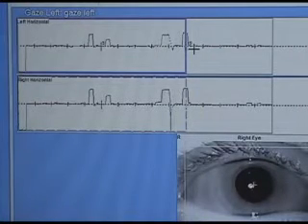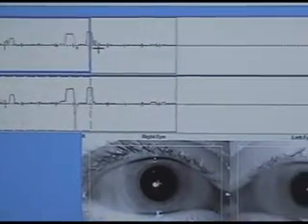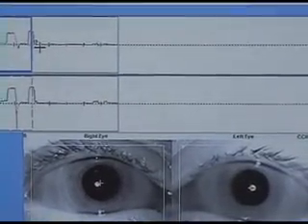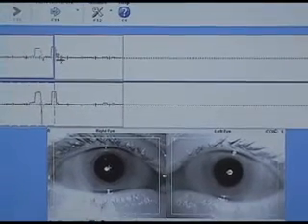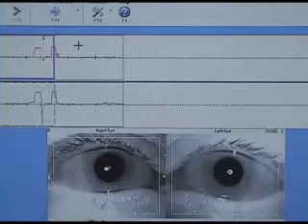It's a failure of a certain part of the brainstem that is not allowing the eyes to remain steady, and we want a nice steady gaze. So we'll show you what this looks like. Again, this is gaze to the left. This is a concussion patient.